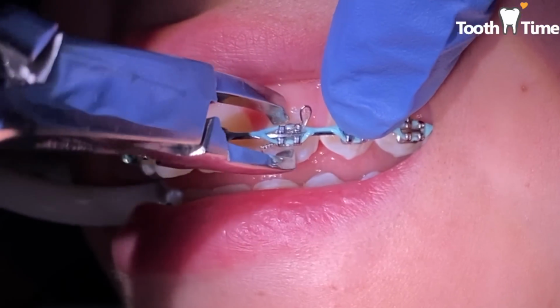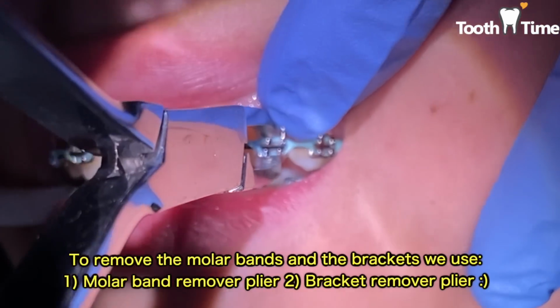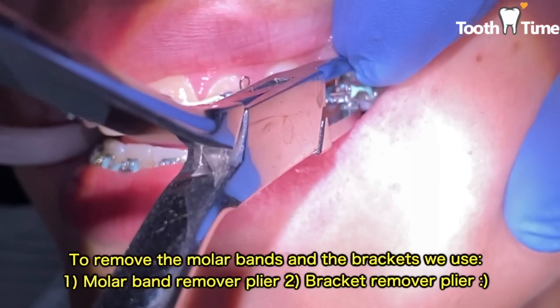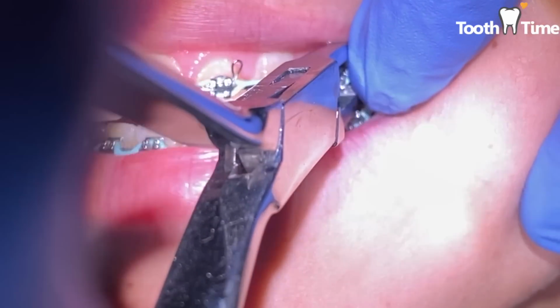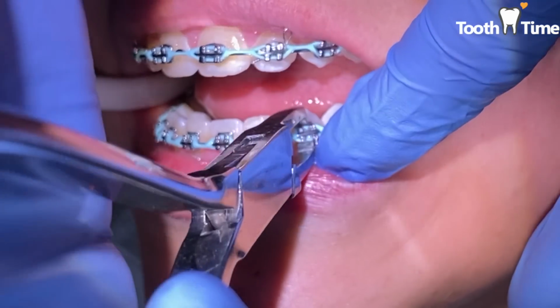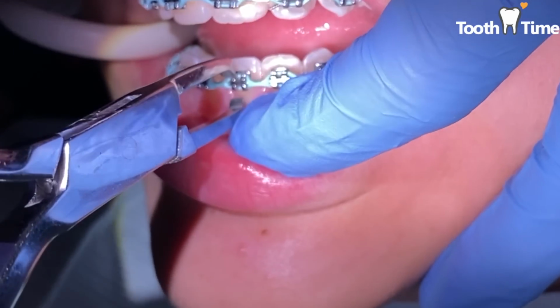So we're gonna go ahead and get started with the appointment. First, we're gonna go ahead and take off all the brackets and all the bands with our bracket remover and our band removal. Once we take all of that off, we're gonna take off some of the blue residue that's on the molars in the back, which is that blue glue that was adhering to the molar bands.